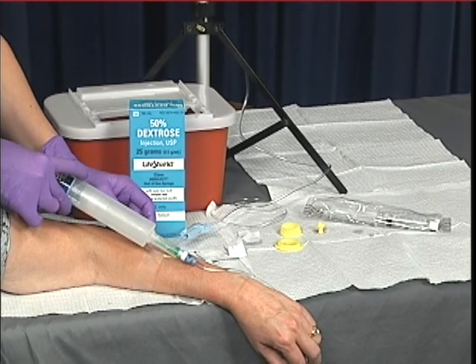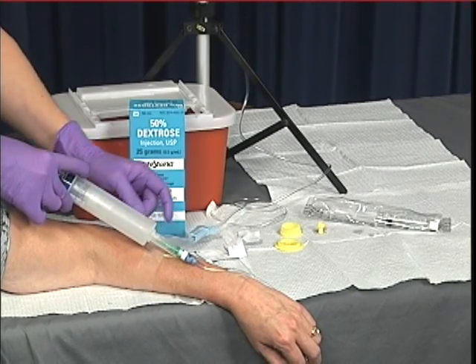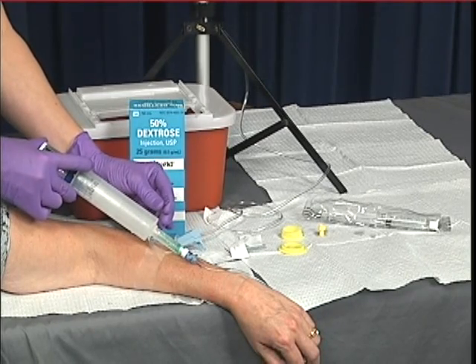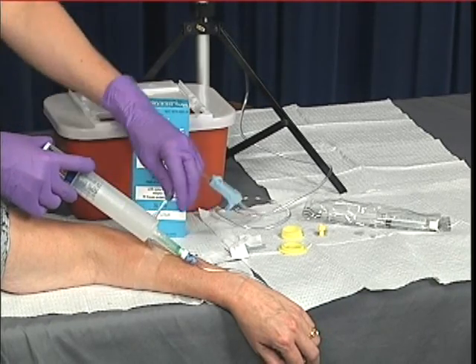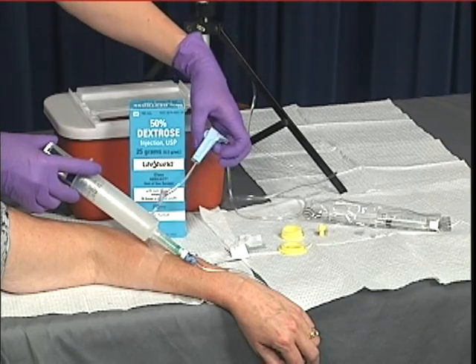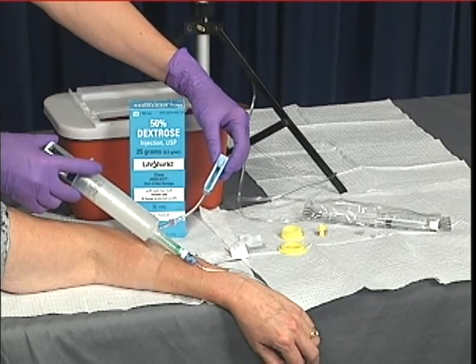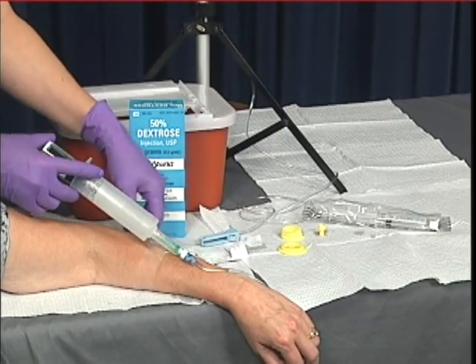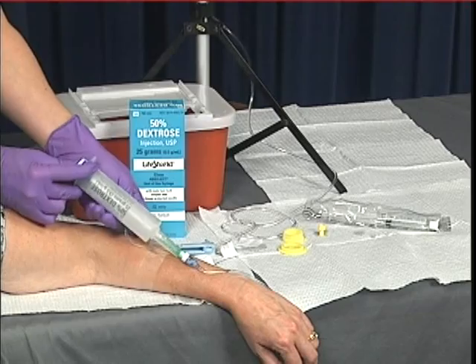When using a medication like dextrose, it's acceptable to flush with the normal saline after half of the medication is administered. If a medication is pushed improperly, damage to the vessels or surrounding tissues may occur. Knowledge of your local protocols will assist you in applying the proper medication administration rates.